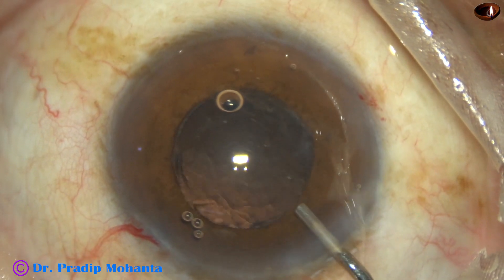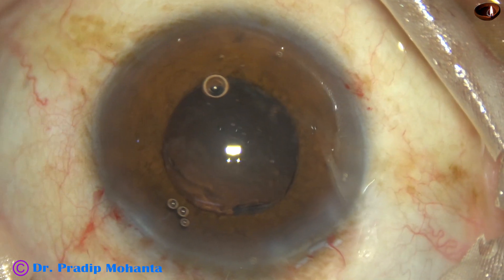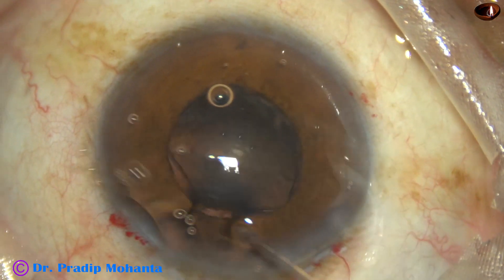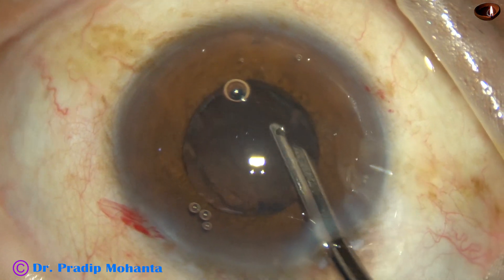Otherwise, if I use the chopper, the pupil will become small, the iris will tend to prolapse through the side port, and a lot of other problems.